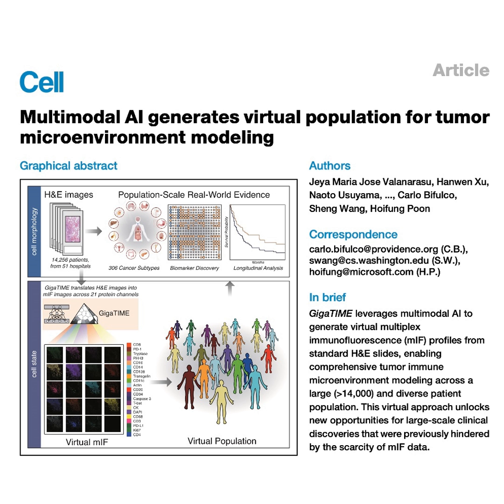They show us cell morphology, the shape, the structure, but they don't explicitly show us the protein activity, the cell's actual state. So GigaTIME learns to connect the two. It learns how the subtle shapes in H&E predict the protein signals you'd see in MIF. It basically teaches the AI to infer, or you could even say hallucinate, that missing MIF data.